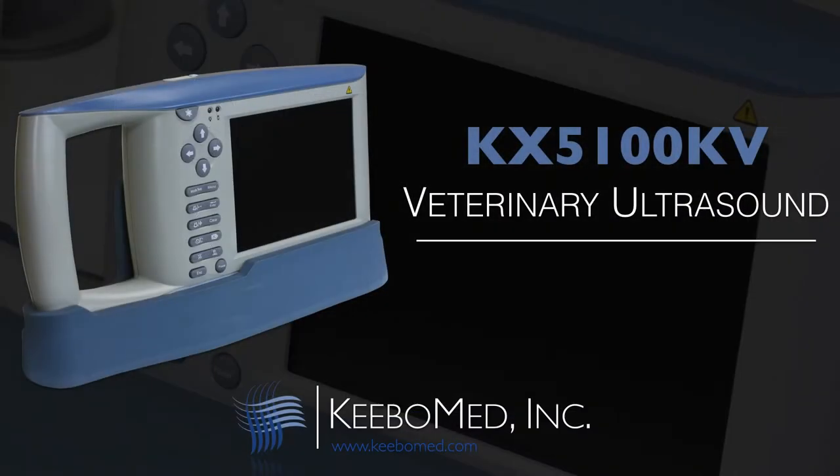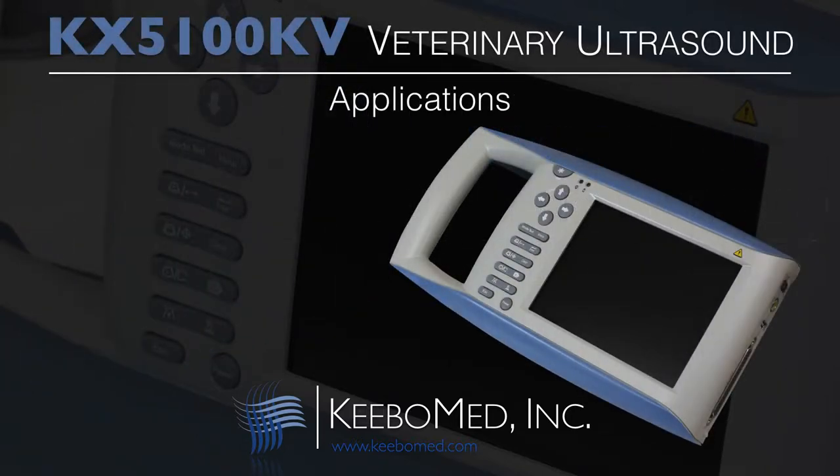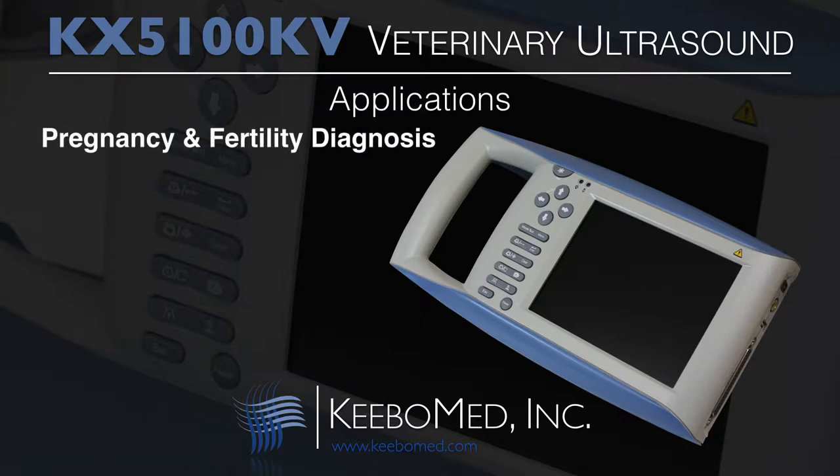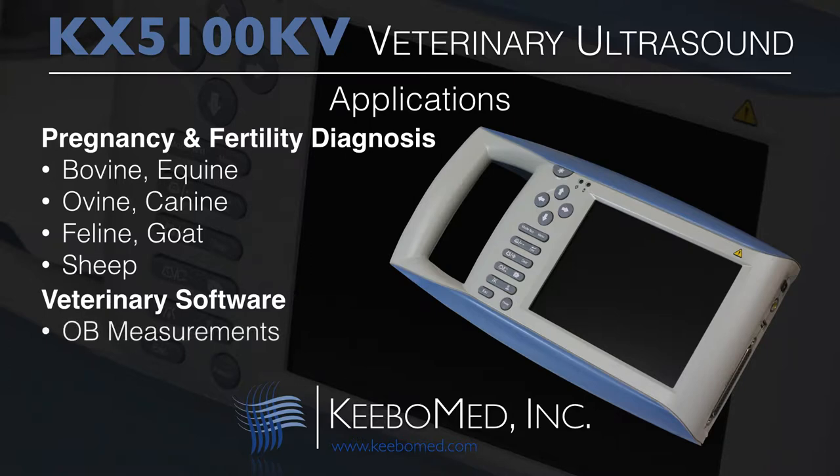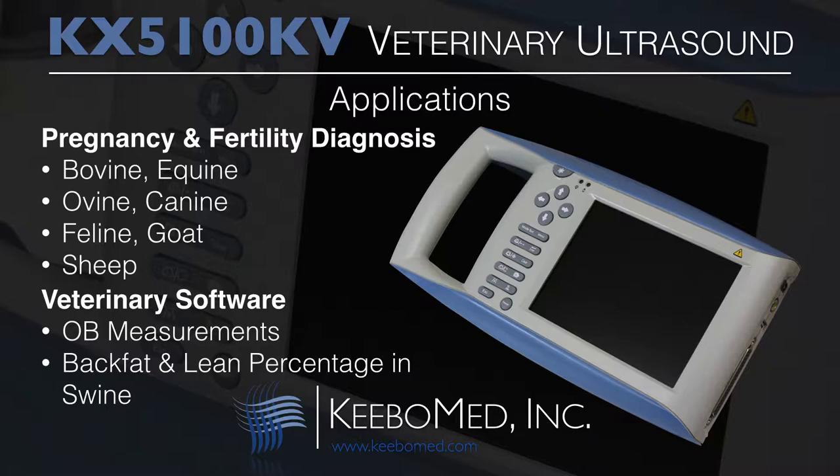The KX5100KV is designed for a number of different applications. It is widely used for diagnosing pregnancy and fertility in larger animals such as bovine and equine. However, the 5100KV will also function well when examining ovine, canine, feline, goat, and sheep. The veterinary software package includes the ability to perform OB measurements and automatic calculations for back fat and lean percentage in swine.